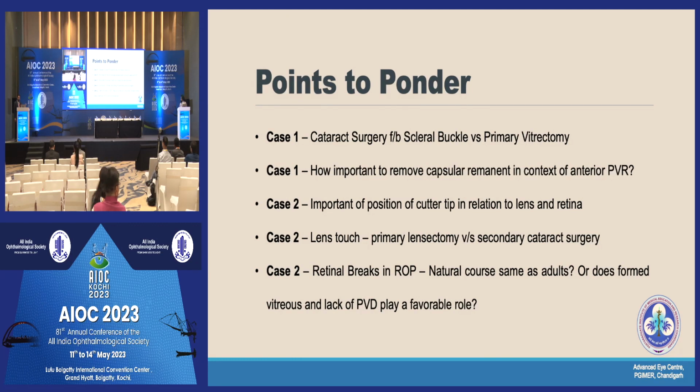Fair enough. And I think there are also some cases reported by the SN group about macular holes forming in these, in which they've actually been able to salvage not just the eyes with attached retina, but with some kind of functional vision. So I think the one good take home is that if you get a break in ROP surgery, you do not want a break. We don't want to go out of this hall thinking that if a break happens, it doesn't matter. You do not want a break, but all is not lost, as is generally said. You try and close it, and depending on how bad the case is, it could still end up with a favorable outcome.